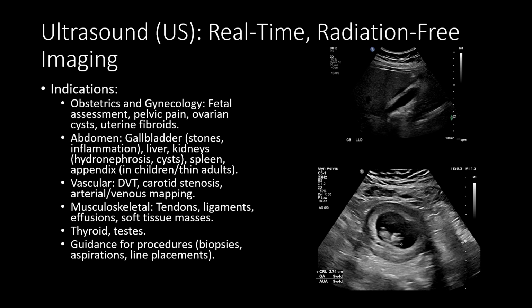We also use it a lot to look at the thyroid. It's the best modality really for thyroid nodules, and we use it a lot for scrotal ultrasound assessing the testicles for abnormalities. Because it is a real-time imaging modality, it's also really good for procedures, so we use it a lot for biopsies, line placement, aspiration, and in that instance, often the person performing the procedure is using the ultrasound in real time to guide their needle or their wire.